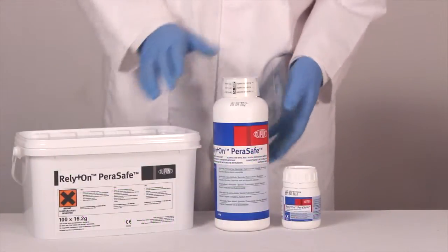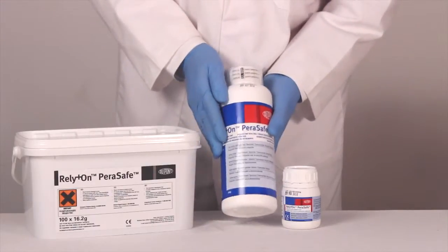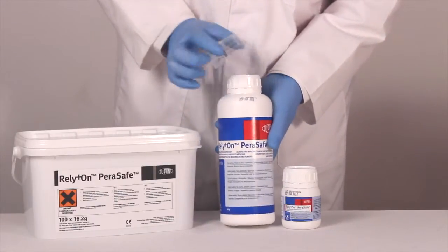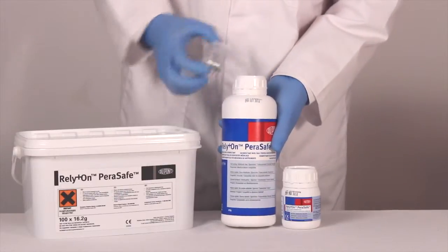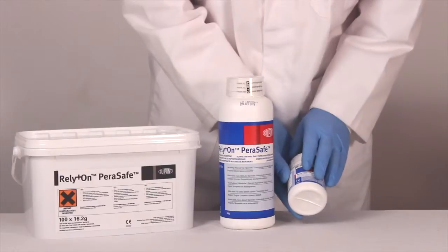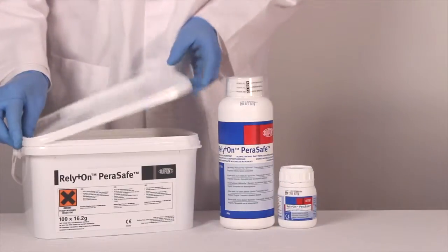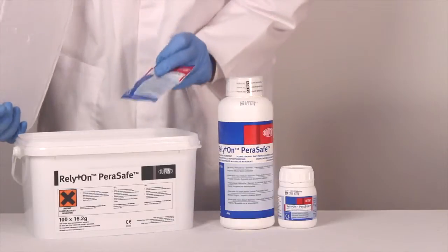This product is available in three pack sizes: the largest pack being the 810 gram bottle, which also comes with a measuring cap. Also available is the smaller use bottle at 81 grams, and for single use we also have the 16.2 gram sachets.